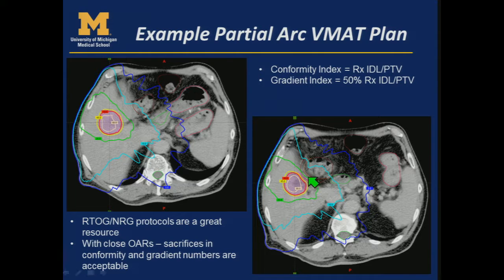And so it's a little bit more acceptable to have kind of a skewed dose distribution, especially when you look at the 50% isodose line. And so here's just an example of that along that colon PRV where we're stretching out that 50% isodose line, and it's not exactly symmetric like you may see on other SBRT plans.